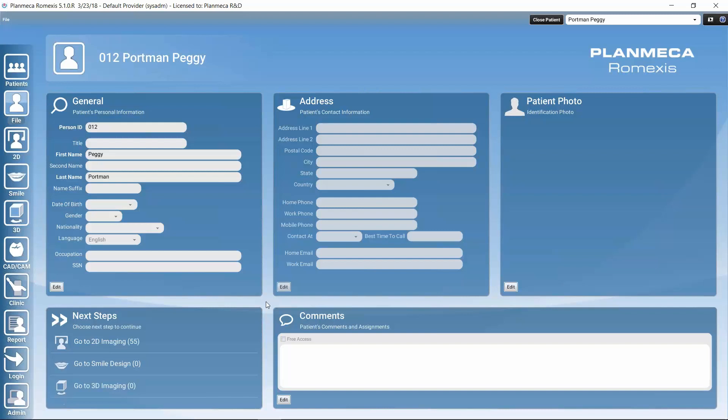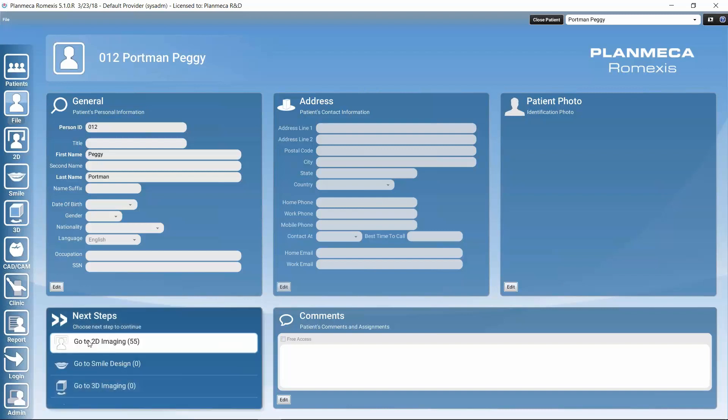In this tutorial, we will take a look at where we can find the studies, how to view them, how to make a new study, add images to it, how to arrange the images in a study, and finally we'll take a look at how we can build our own study templates in the admin module. So let's go to the 2D module so that we can find our 2D image templates.